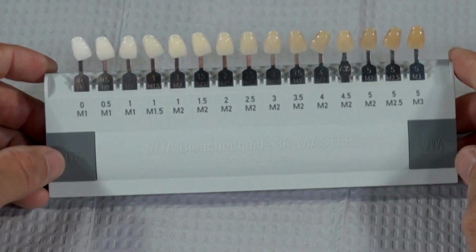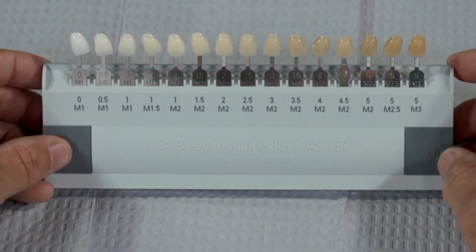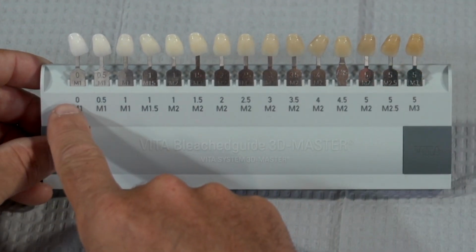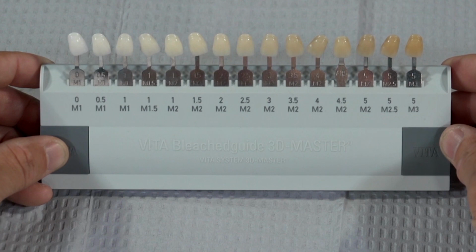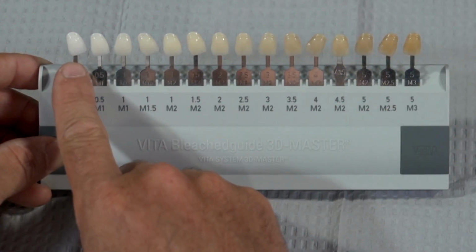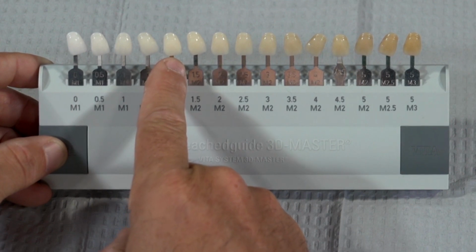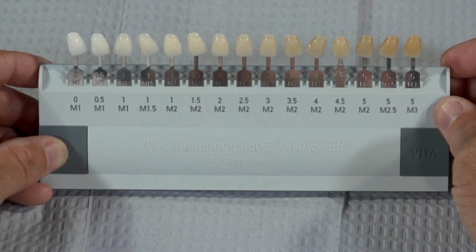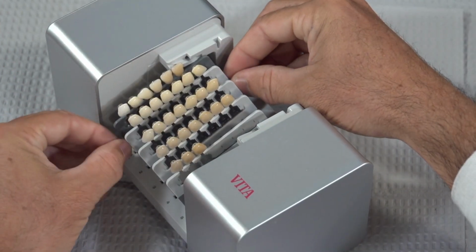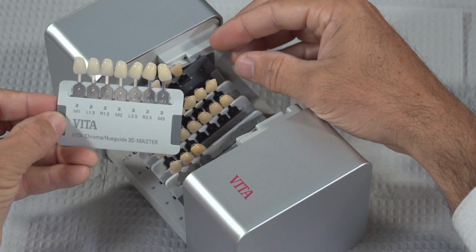Another option is the Vita Bleach Guide. This guide has only one additional shade tab than the Vita Classical Guide, but the colors are spread out on a broader spectrum, actually exactly twice the coverage as the Classical Guide. Now this makes it less complicated for our eyes to notice the difference. True to its name, however, this guide is best used for patients who are involved in chairside or take-home whitening procedures. The Vita Linear Guide first groups and then separates tab groups according to the value before hue and chroma are taken into consideration.